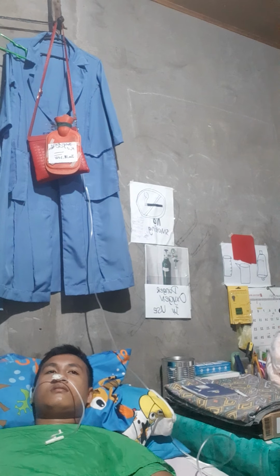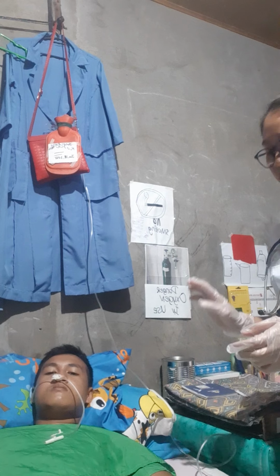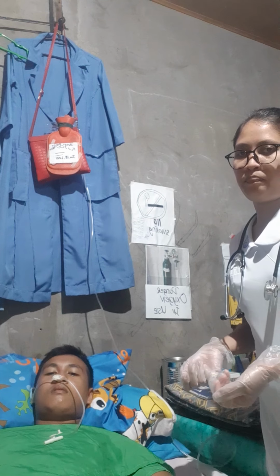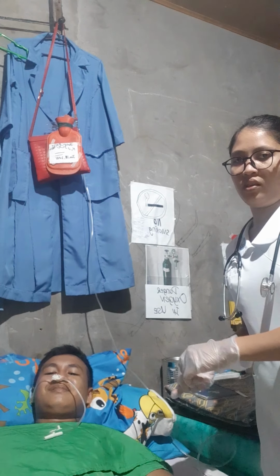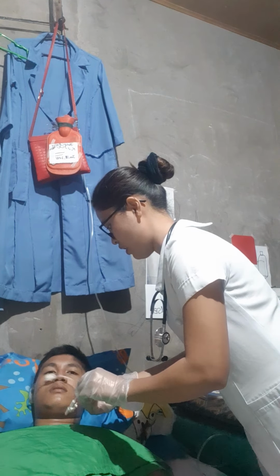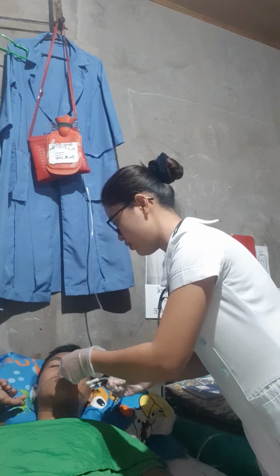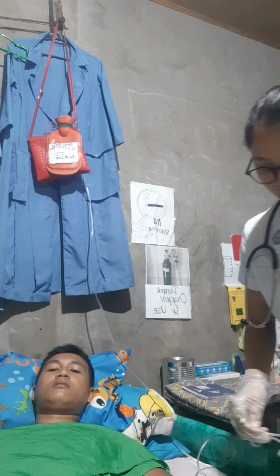Then pinching the tube prevents any content from draining, so we need to pinch the tube before removing it. Then smoothly withdraw the tube. Sir, can you please take a deep breath and hold it. Slowly remove. It's alright. Sir, can you please wipe your nose and mouth for the secretions?